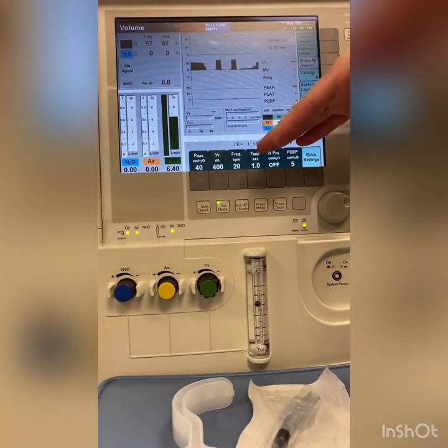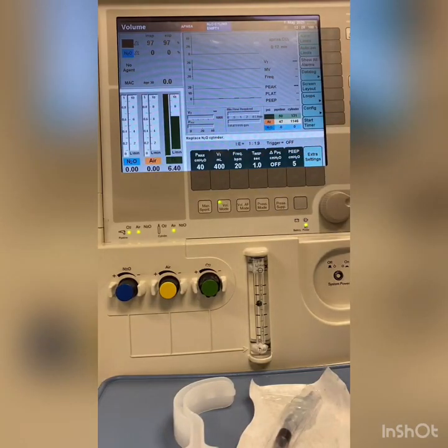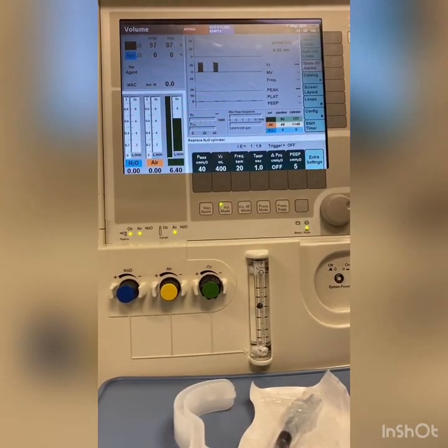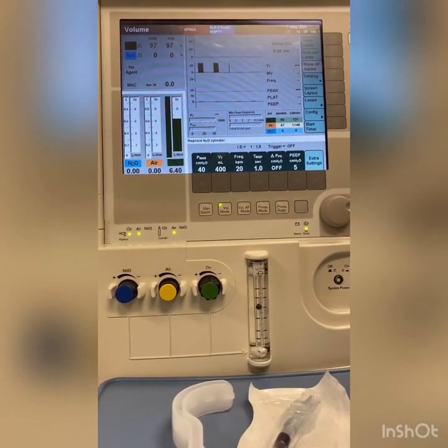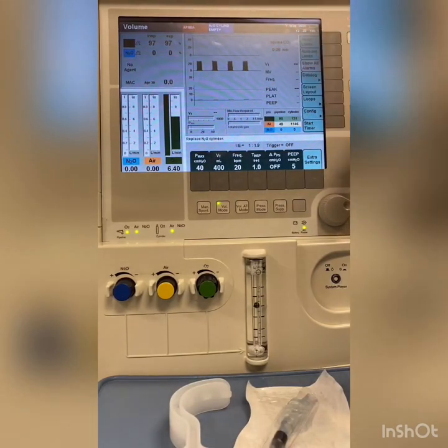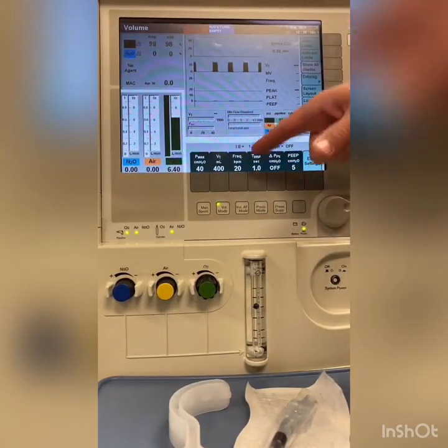That's what a typical adult, kind of the max of what they would breathe. At that point is when I switch over to increasing either the PEEP a little bit more or start increasing the tidal volume. And then when I decrease, going the same way, I want to do rate first.